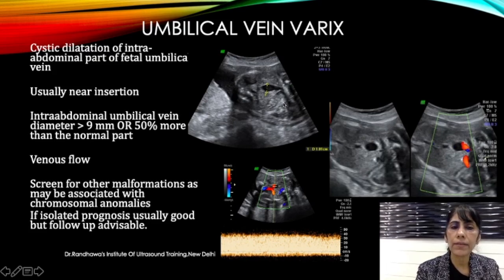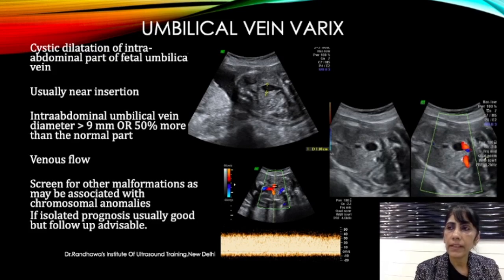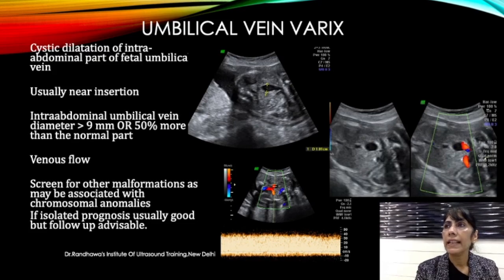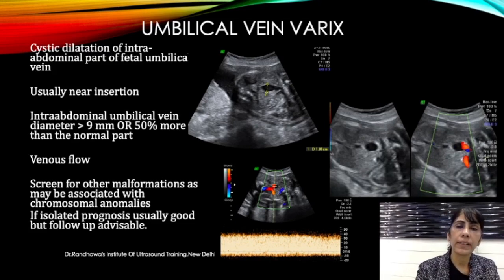Once you put color, you can apply spectral Doppler and you will notice it shows the typical venous flow as seen in the umbilical vein, which confirms all your findings. Diagnosing or searching for this is not difficult. The only confusion is what cutoff to use — either more than 9 mm, or more than 50% dilated compared to the normal portion of the vein.